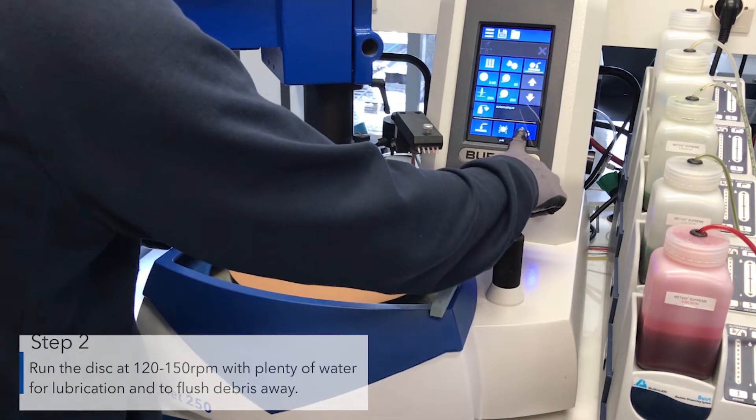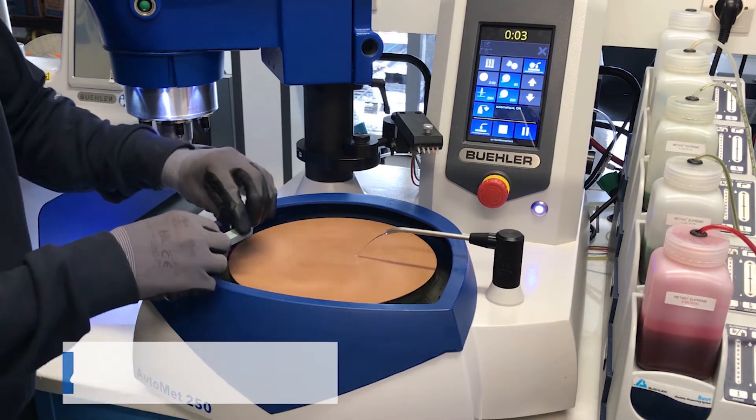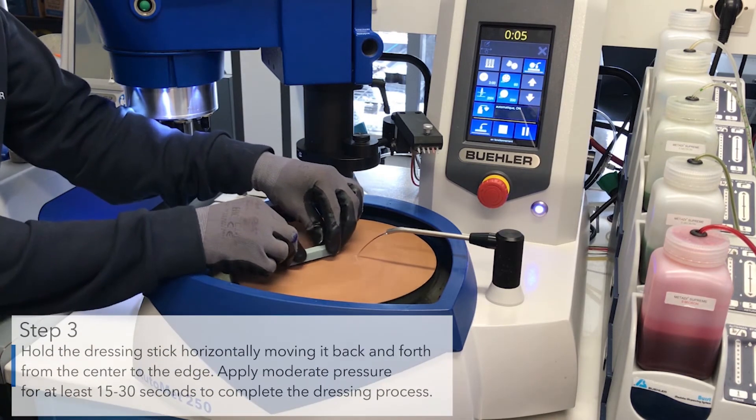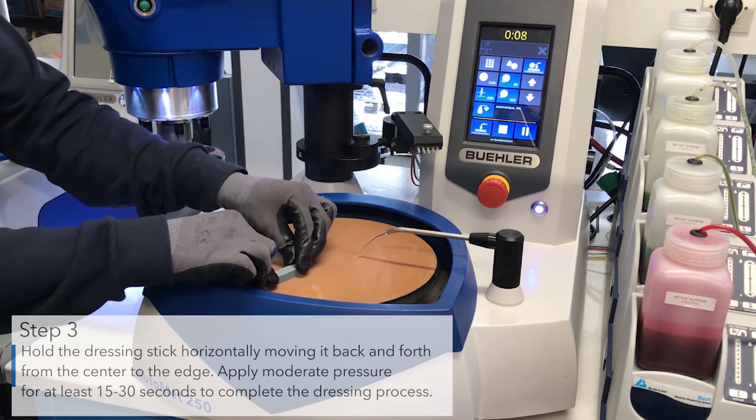Run the disc at 120 to 150 revolutions per minute with plenty of water for lubrication and to flush debris away. Hold the dressing stick horizontally, moving it back and forth from the center to the edge.